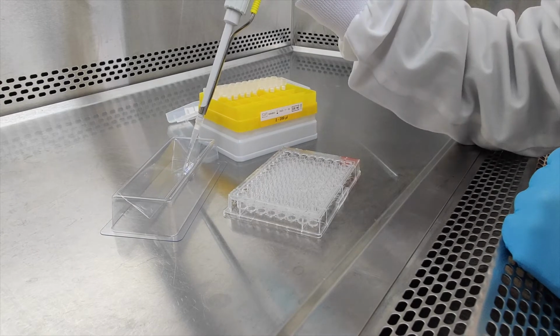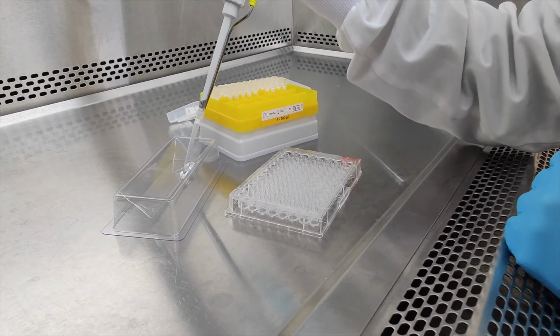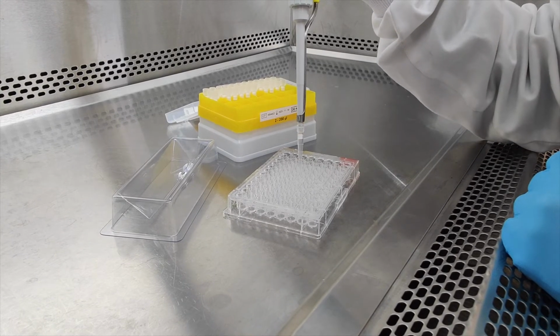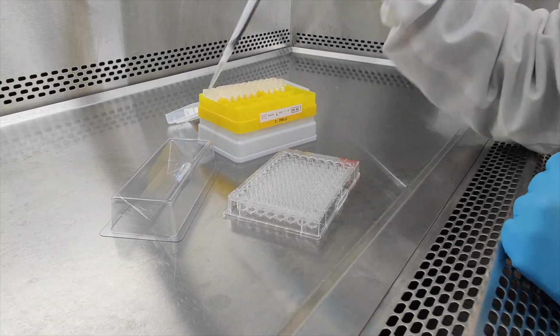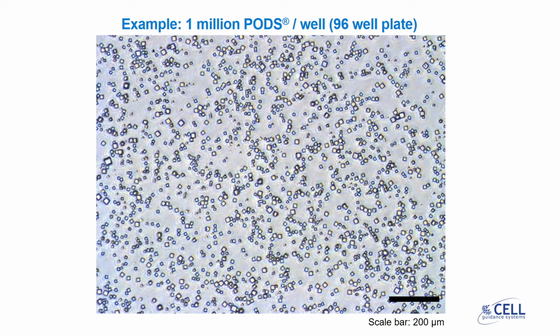Leave the well plate with the lid off under sterile conditions for an hour to allow pods to dry. Alternatively, leave in the fridge with the lid on overnight. Once dry, inspect the wells with pods under a microscope. The pods should be uniformly dispersed across the surface of the wells.